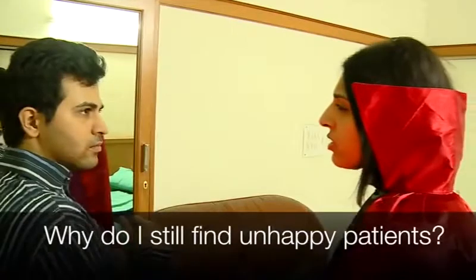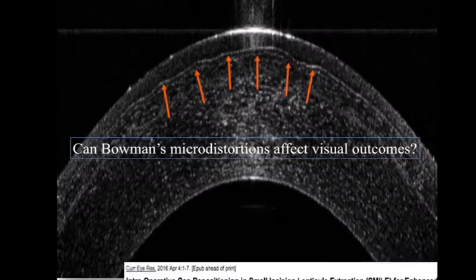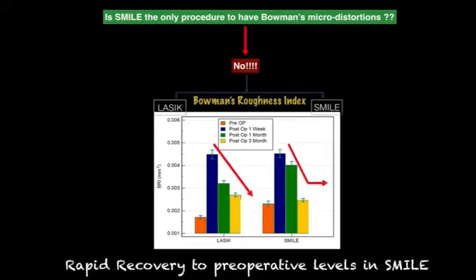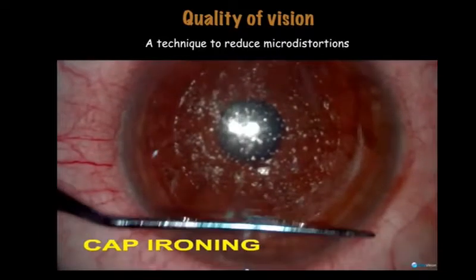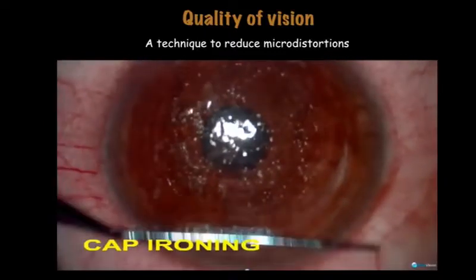Why are my patients still not happy? To find out, we performed high definition spectral domain OCT on them and found Bowman's micro distortions in both LASIK and SMILE. SMILE, however, showed a more rapid recovery to preoperative levels. We also found that cap ironing at the end of SMILE, though a simple procedure, helped reduce these micro distortions and improve visual quality post-operatively.